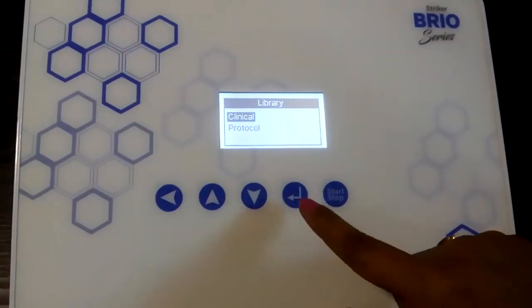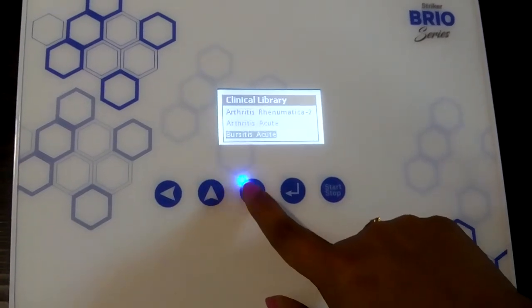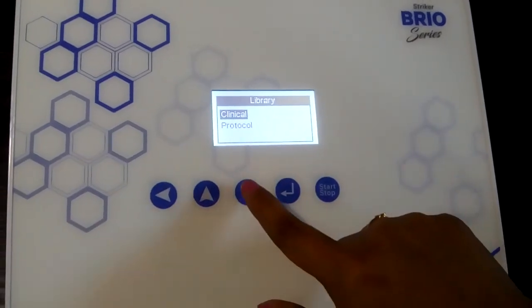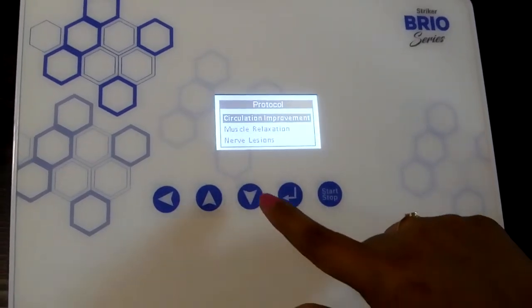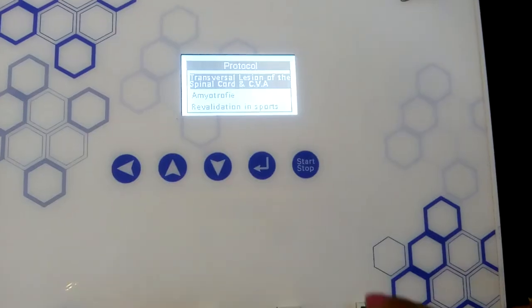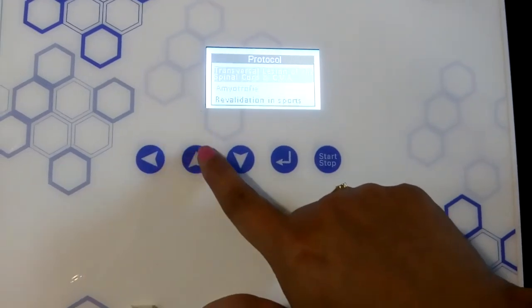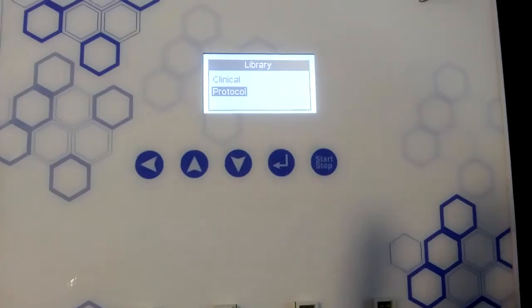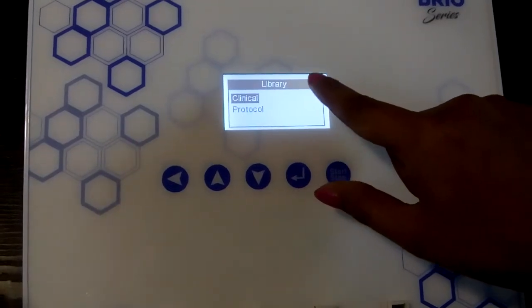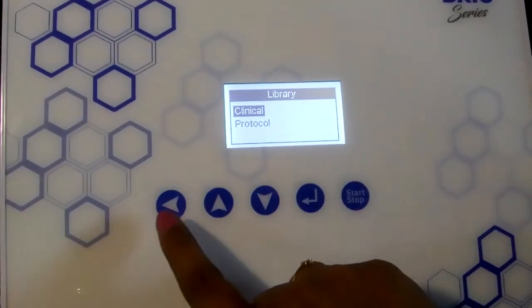To go into the clinical library, press the enter button — there are a total of 19 libraries. To come out of the clinical library, press the back button. To go to the protocols, press the down button and then the enter button — there are 26 user protocols, which are basically for the NMAS current. The clinical library contains 19 libraries which are a combination of IFT currents and TENS current. To come out of the library, press the back button.